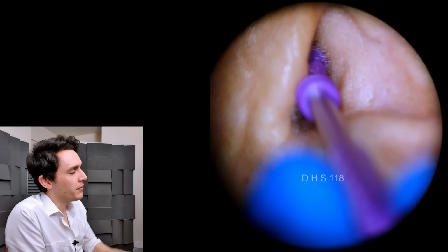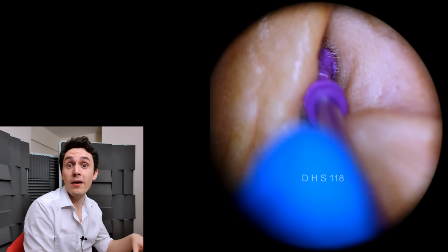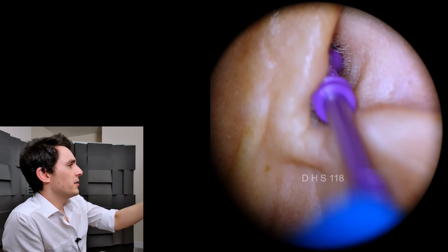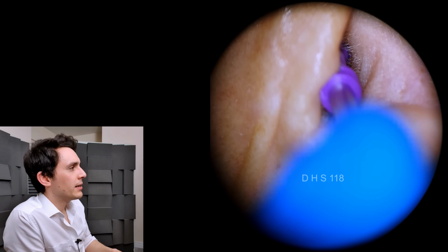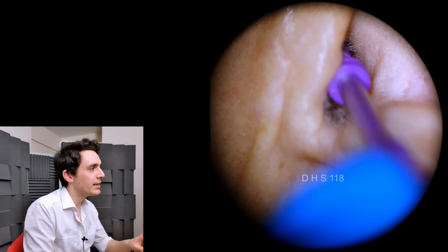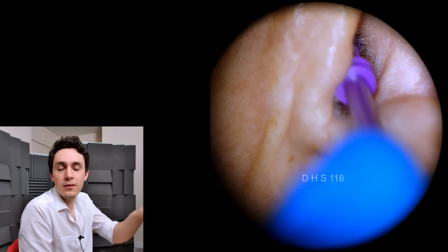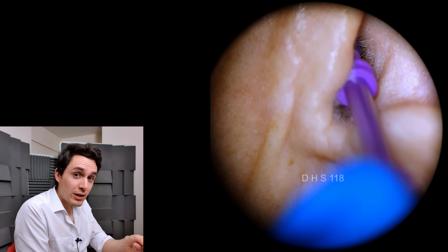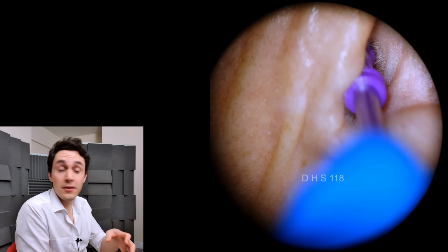So what I'm doing here, now this patient has fairly dark impacted wax, and there's so much of it in there that I'm going to use two devices on this patient. As you can see, I've just inserted it into the ear canal, and I'm turning it very, very slowly. Usually once you've inserted it and start advancing it, it normally takes around 40 to 50 seconds to gently achieve the desired depth. Once you're at that depth, you give it a little bit more of a turn, and then you gently pull it out. Most of the time that doesn't hurt the patient.